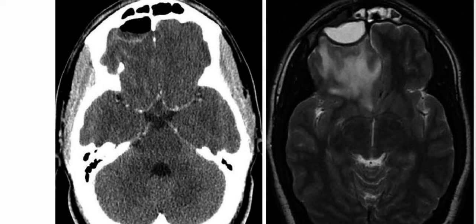You can see that there is a rim enhancing epidural fluid collection with air fluid level, which is overlying the right frontal lobe. On the follow-up axial T2 scan, there is the epidural collection which is hyperintense, whereas its rim and the underlying dura are hypointense. So on the T2 scan as well, this epidural collection is noticed.